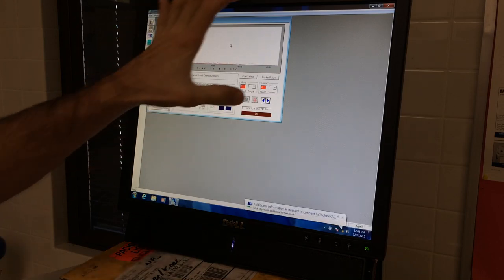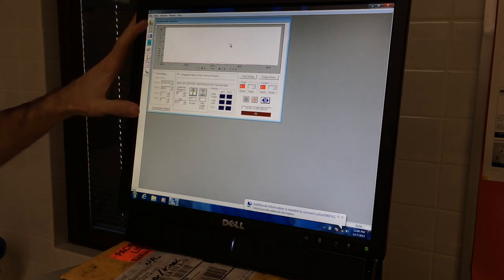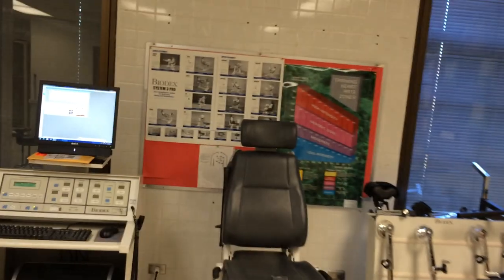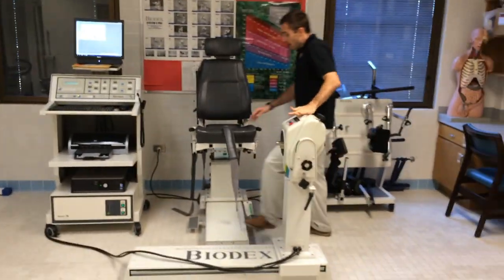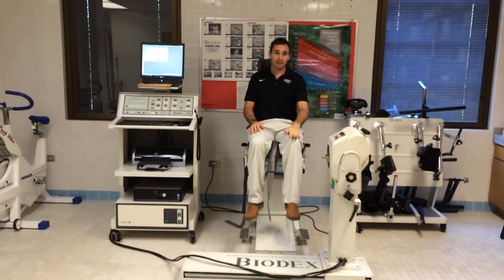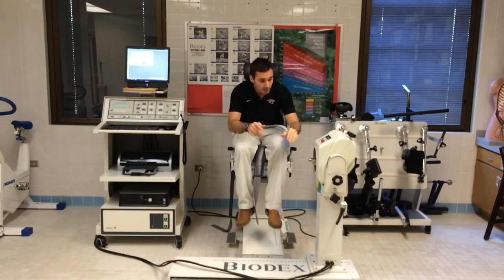At this point, it brings up our operation screen. So we can be done with the computer for a few minutes at this point. We need to focus on the setup of the rest of the equipment. So the first thing we want to do is make sure that we have this set up for our subject. If I'm sitting here, you can see that I would be aligned to my left leg. Being that we're testing Bo's right leg, we need to do some adjusting.